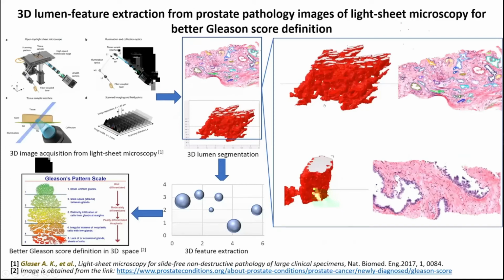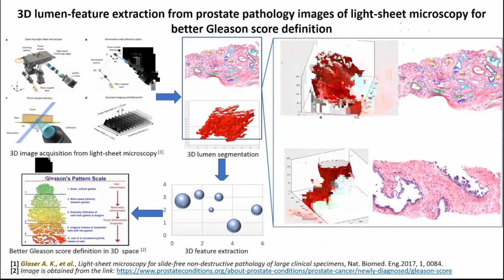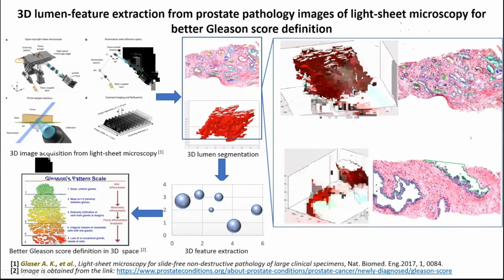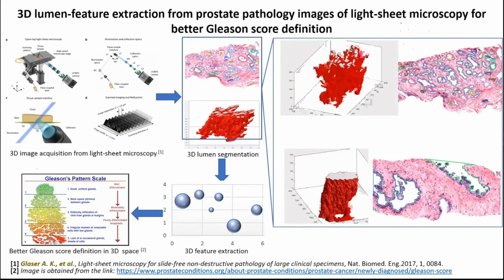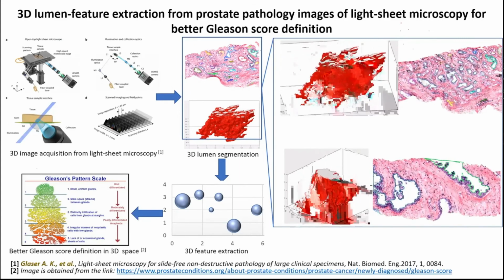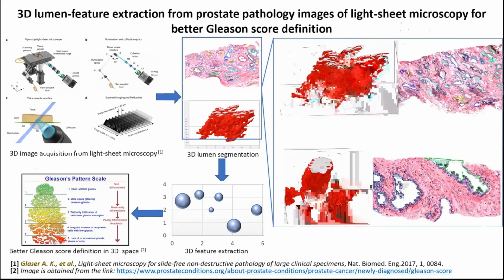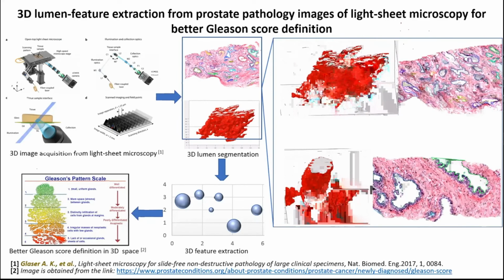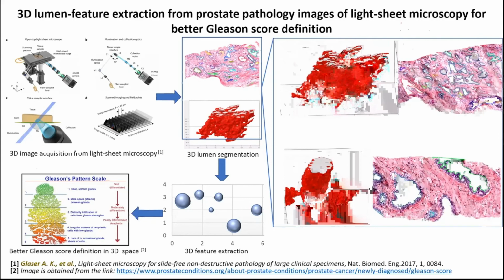And then finally, I just want to end with just a shout out to some amazing technology developed at UW, thanks to an amazing collaboration with Dr. Jonathan Liu in mechanical engineering. Jonathan and I connected a couple of years ago, and since then been having a lot of fun. I certainly have, in taking the approaches we've developed in 2D pathology and applying it to 3D light sheet microscopy.